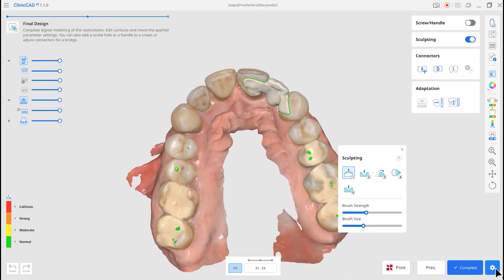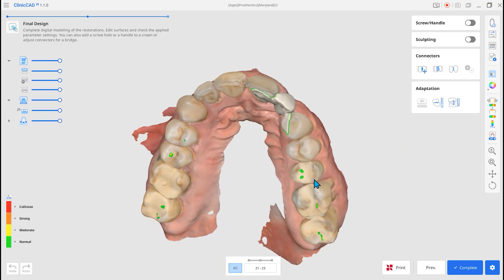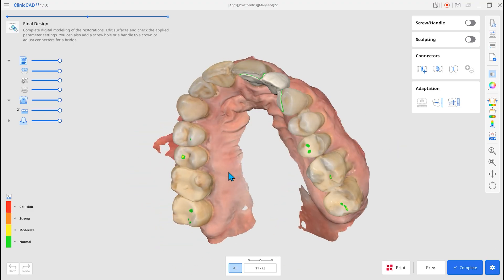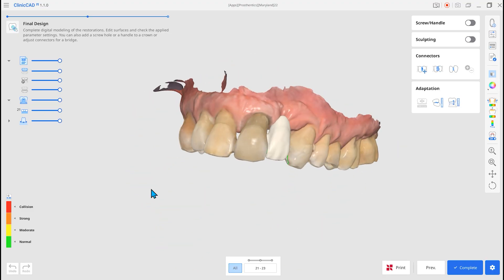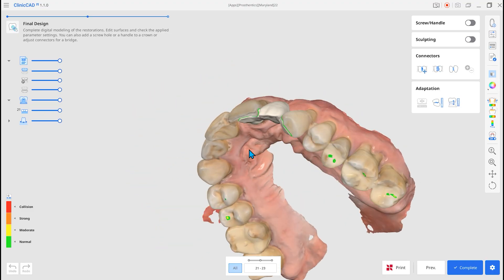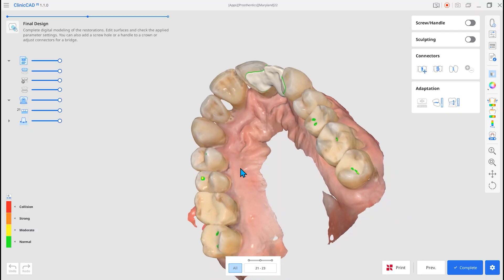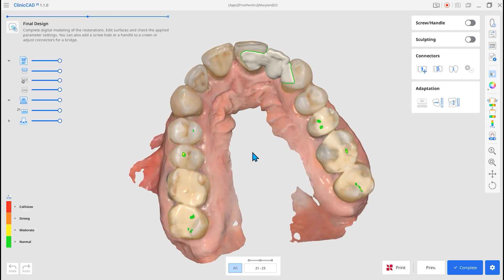Once you merge the Maryland Pontic and Maryland Wing, the Maryland Bridge is created. Maryland Bridge restores a missing tooth with minimal preparation of adjacent teeth.